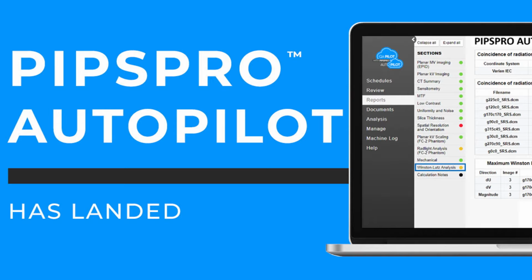I am the product manager for multiple product lines here at Standard Imaging, including our software as a service product QA Pilot, and now PIPSpro AutoPilot for automated image QA. Before we get started, this is being recorded and will be available on our website shortly. So now on to the presentation.